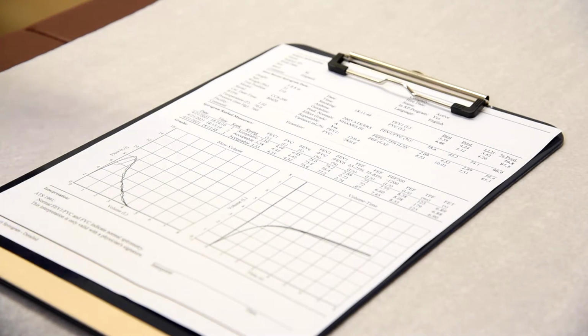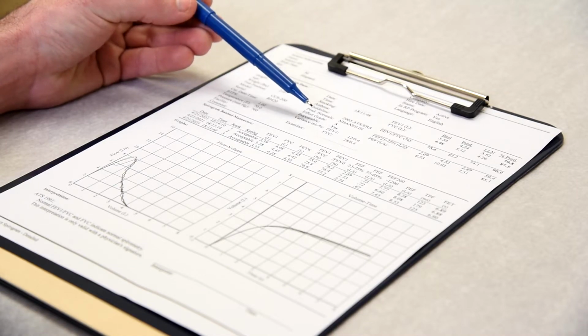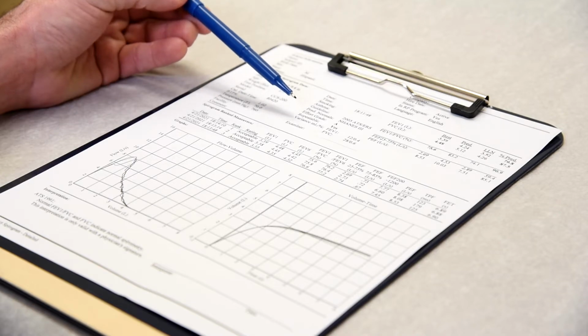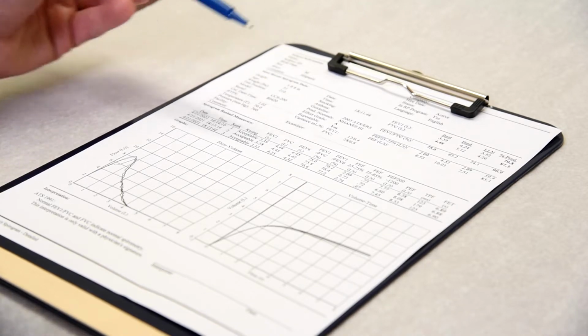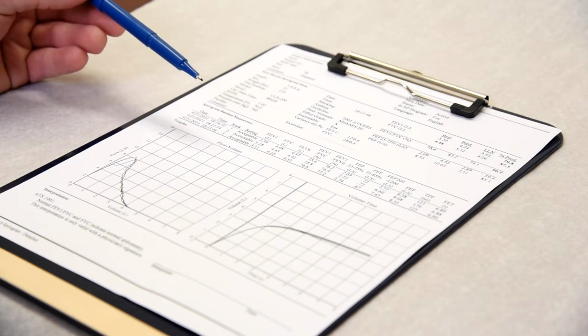If you notice, the machine here will give us an effort grade of A. That means that the test was completed and it is repeatable, which it also indicates. So the patient understood the test, they were able to do the procedure without fail, and you were able to get 3 readings, 1, 2, 3, that are repeatable and acceptable.